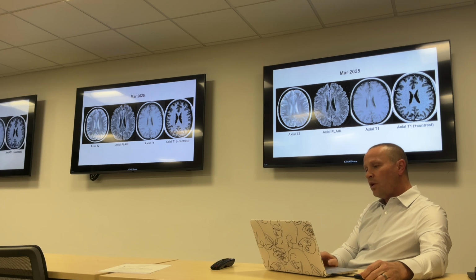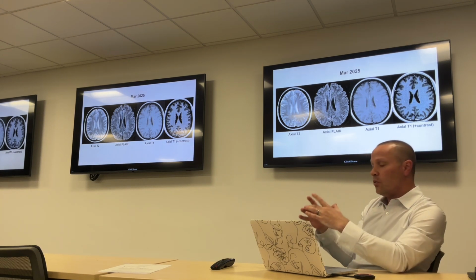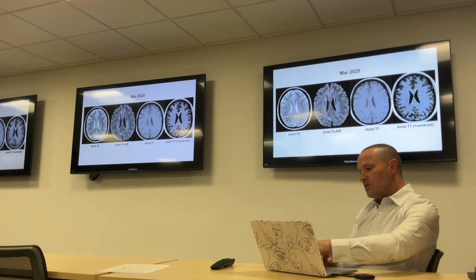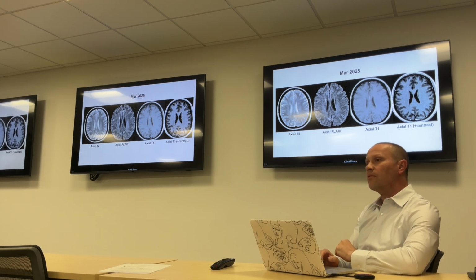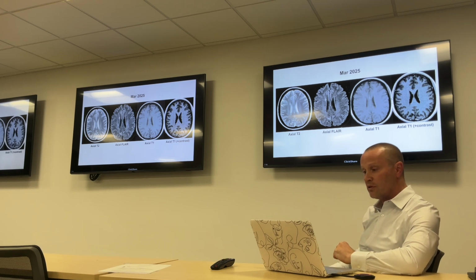There are two big parts of MRI, T2 imaging and T1 imaging. T1 imaging is not as good for seeing the lesions themselves. This is the same picture, and you can see the lesion right there. But you would never want to depend on this image to find that lesion. It looks just like the gray matter next to it. It's indistinguishable, not conspicuous at all.